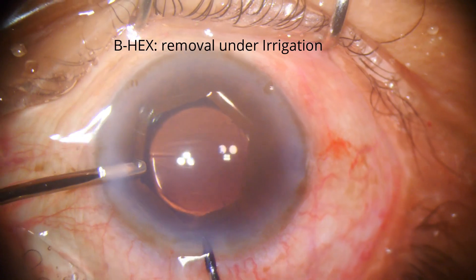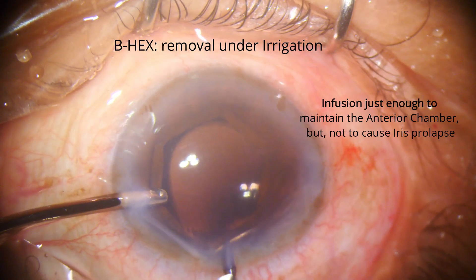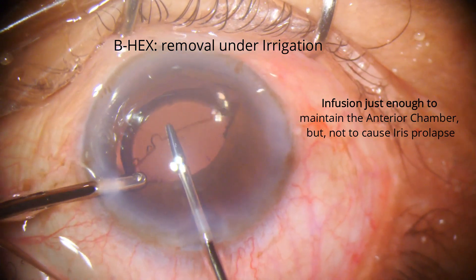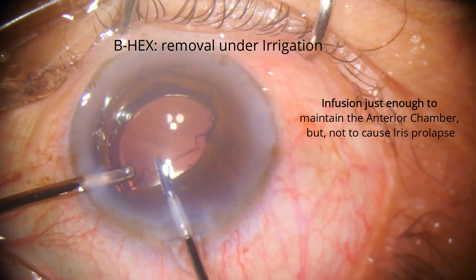For surgeons who prefer IOL implantation under irrigation only, with no OVD, the B-hex can be easily removed under irrigation too.